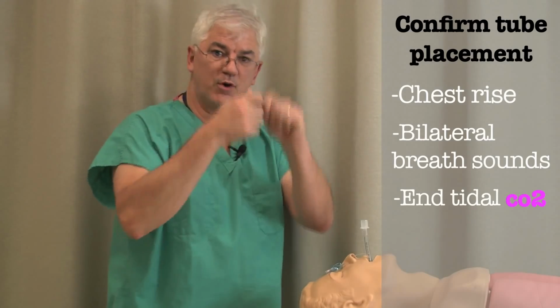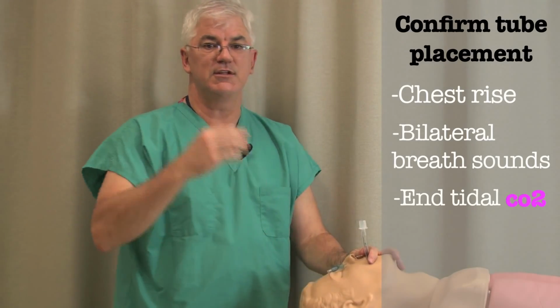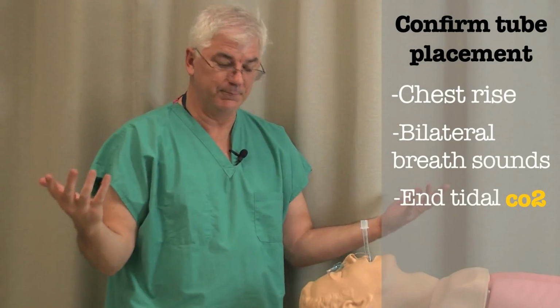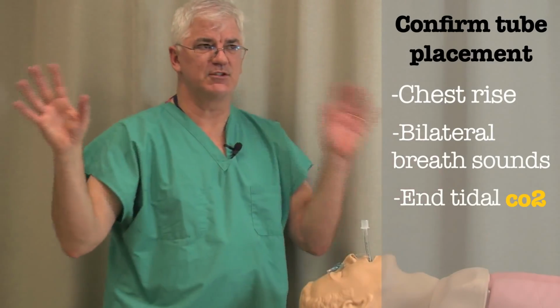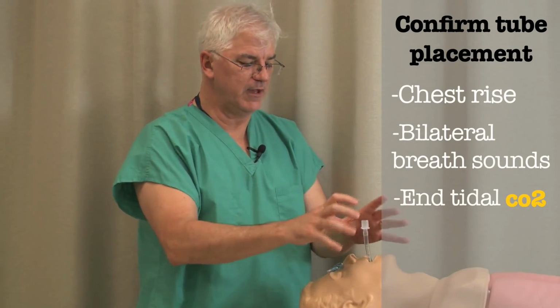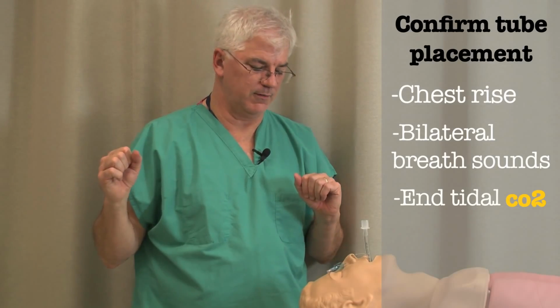The usual portable kind we use at codes and stuff, you'll see it goes from a purple color to a gold color. So we'll hook it up and we'll say, oh, we're golden. There are a few exceptions when it wouldn't turn gold, but we don't really need to go into that now. So you make sure you're in the right place and then hook up your ventilator.